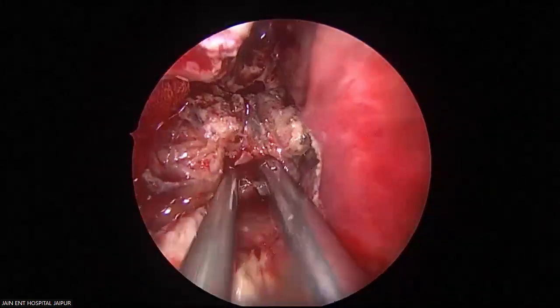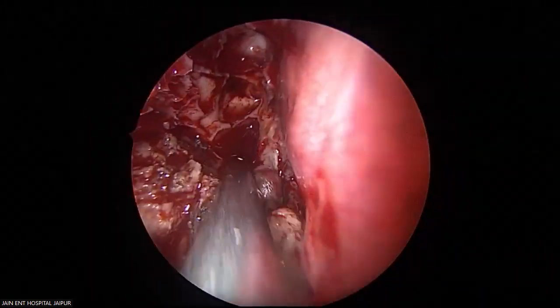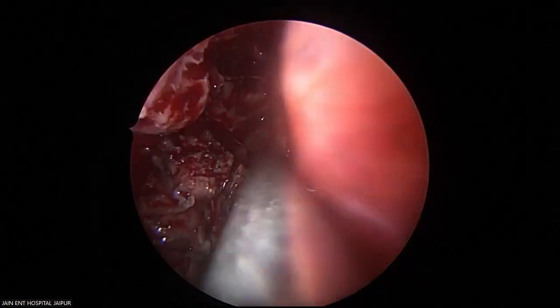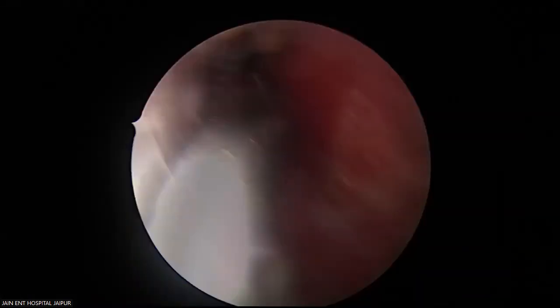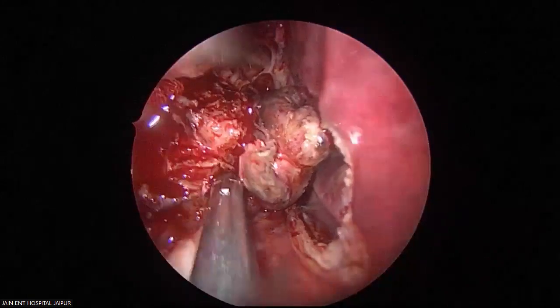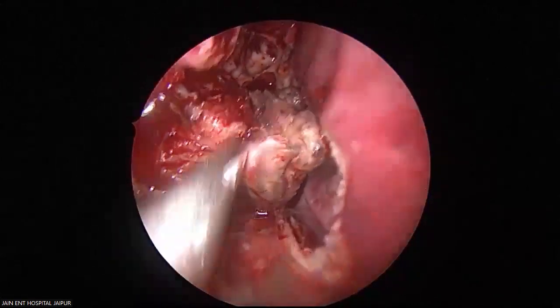See my basic exposure? Yes. That is the point at the junction of medial and lateral component. This is medial, this is lateral. Section. Can you see the distinction very clear? Clear or not? Yeah, clear, sir. Looks like polyp only now, bloodless field. No, it has blood. Bipolar.